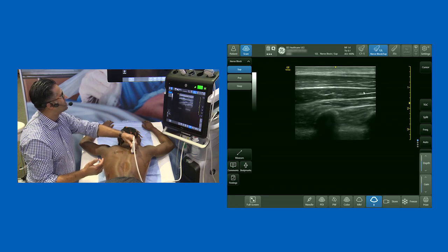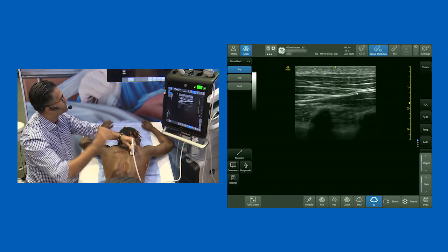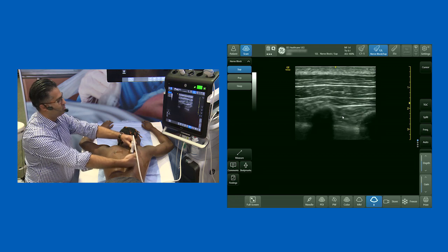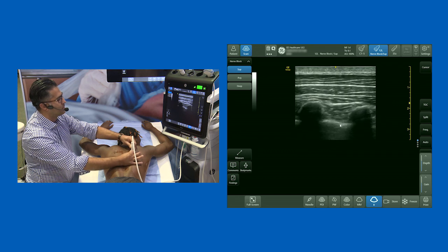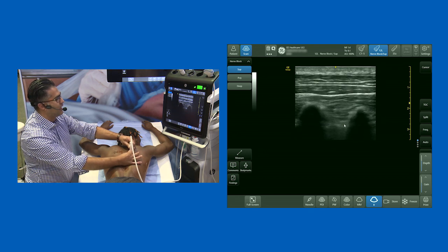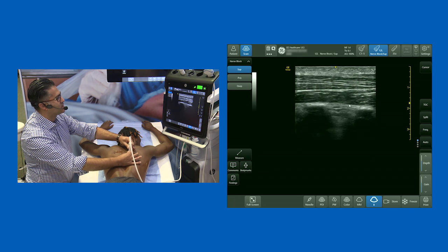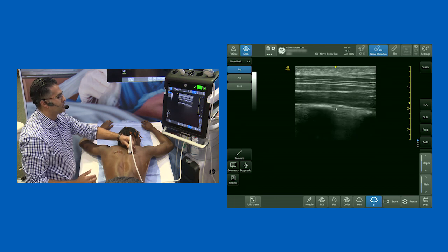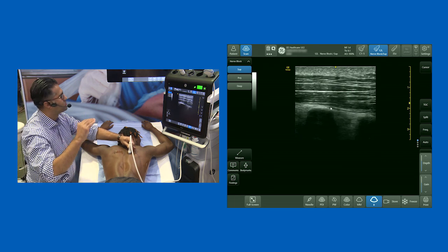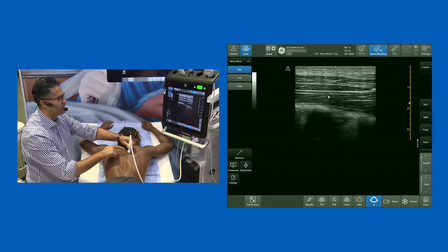This demonstrates trapezius and rhomboid. As we go down, that must be about the T7 level — rhomboid disappears. Now I'm going to slide from lateral towards the midline. I'm definitely scanning over ribs; the intercostal space is between there, the intercostal muscles are there, and that's pleura sliding. As I scan towards the midline, the ribs come down and are then replaced by a really beautiful flat view — that view is the transverse process.